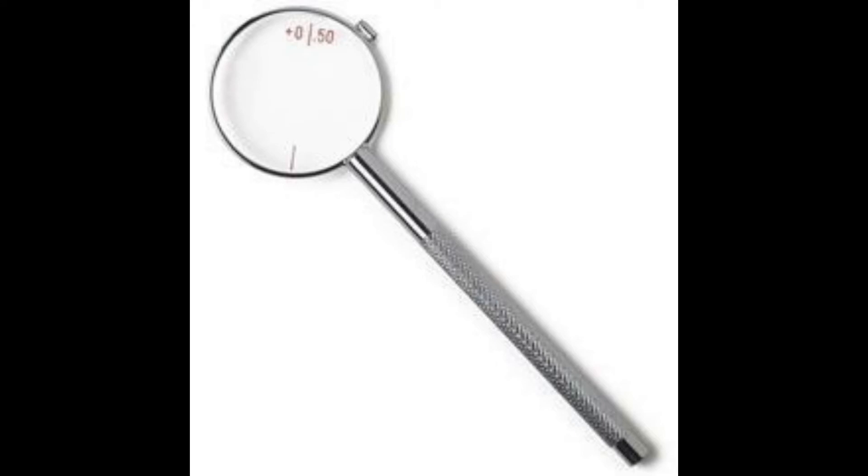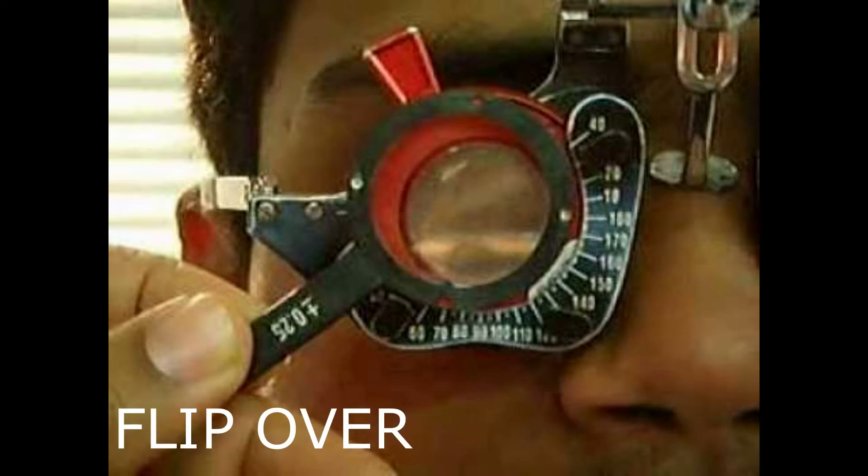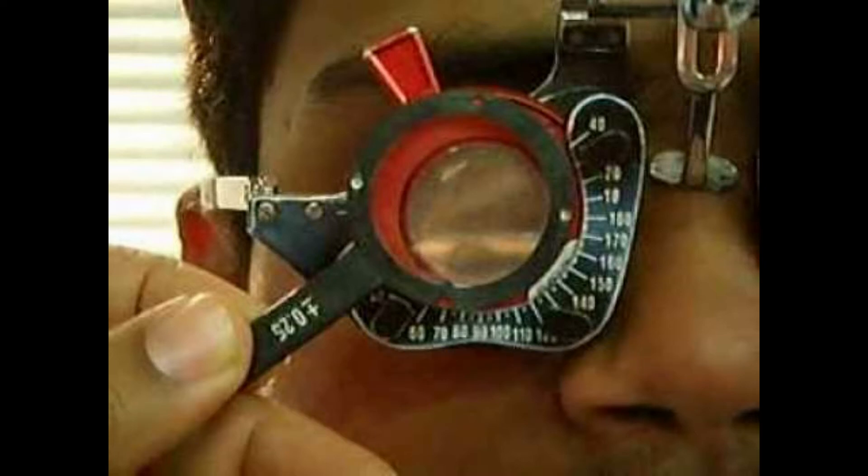If your starting point is the objective refraction results, align the dots in the Jackson Cross Cylinder with the axis on the trial frame. Then flip over and ask the patient if the view is clearer and sharper. If the patient does not see any difference between the two choices, then he does not need a cylinder and this process stops there. But if he does, then he needs a cylinder.